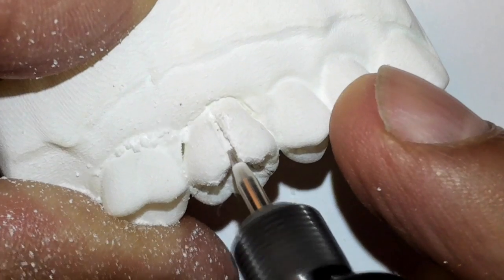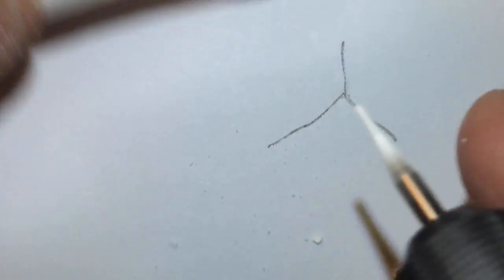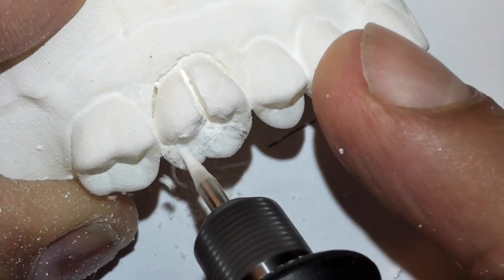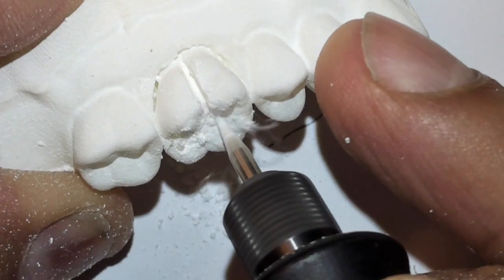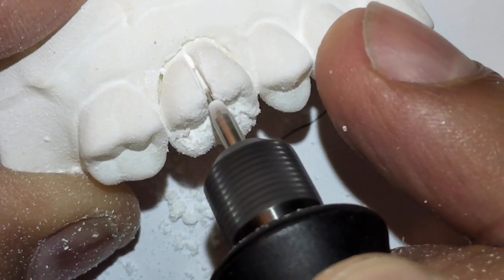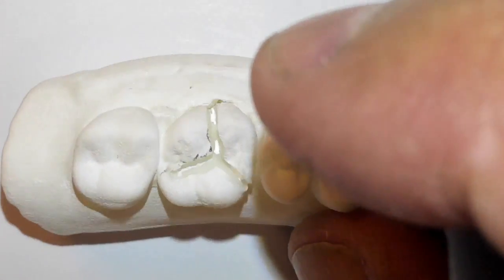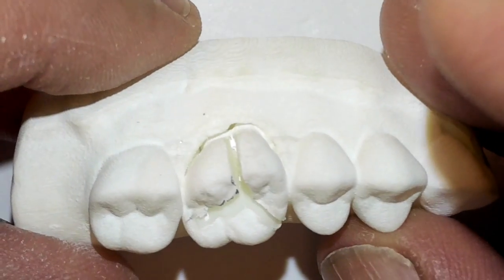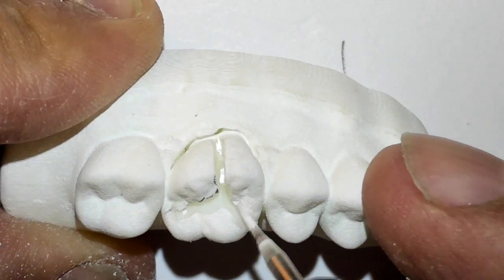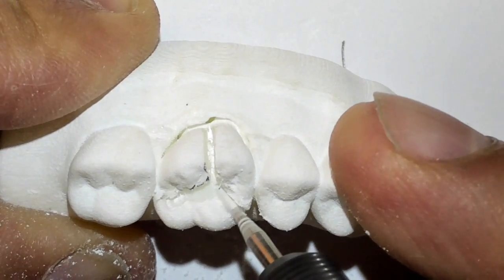New technology — anything's possible in dentistry. Brand new technology. The print company is called Whitmix, and I basically gave them everything they needed to create this printed model. So I'm just slowly going at it here. I use my canned air from Office Depot to dry it out and you're going to start to see how far your cut goes in. You can section the crown portion off and then just go at it — that's one method. Let's continue to cut through this section very nicely. Now you might have to widen the top of your cut.